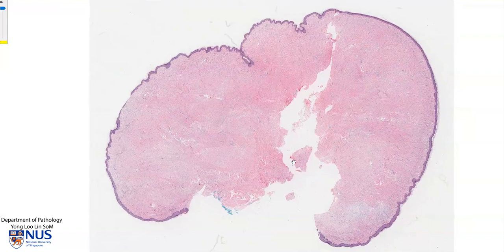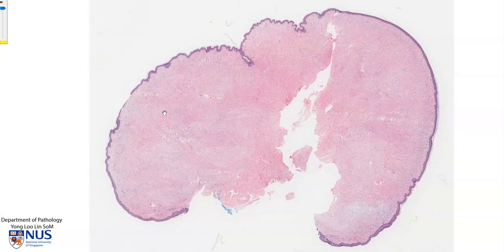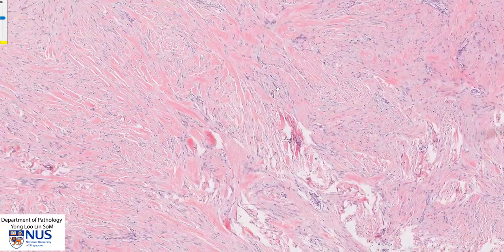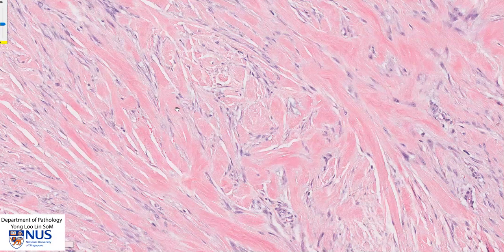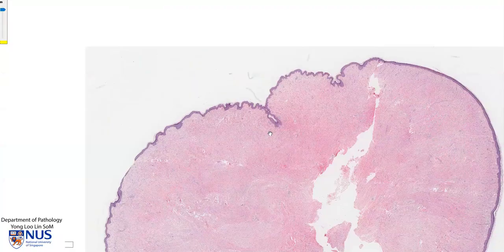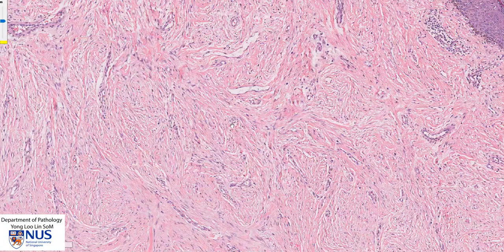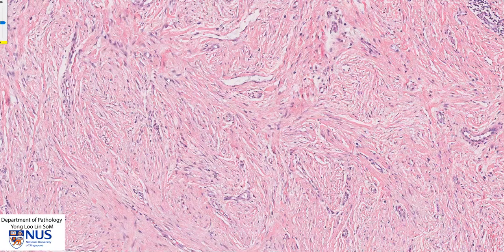In summary, this is an example of a keloid, which is a phenomenon of excessive scar formation. The classical histologic appearance is the presence of these thick, ropey collagen bundles with interspersed fibroblasts. This particular case also has accompanying hypertrophic scar tissue with lots of myofibroblasts as well as fibroblasts, which are laying down these thinner bundles of collagen.